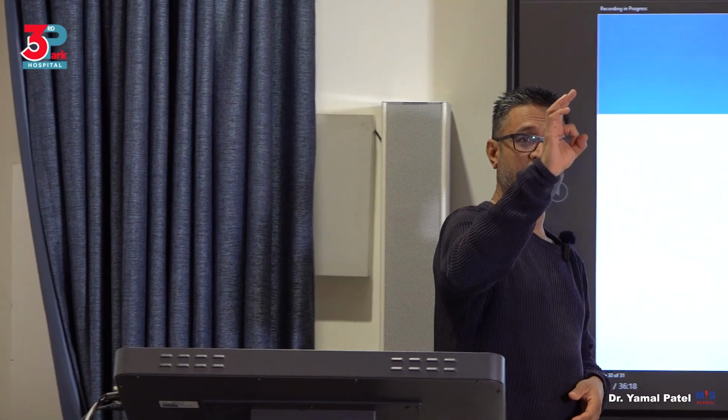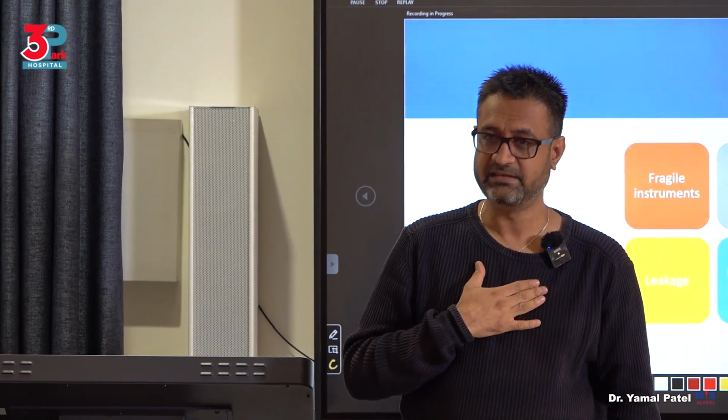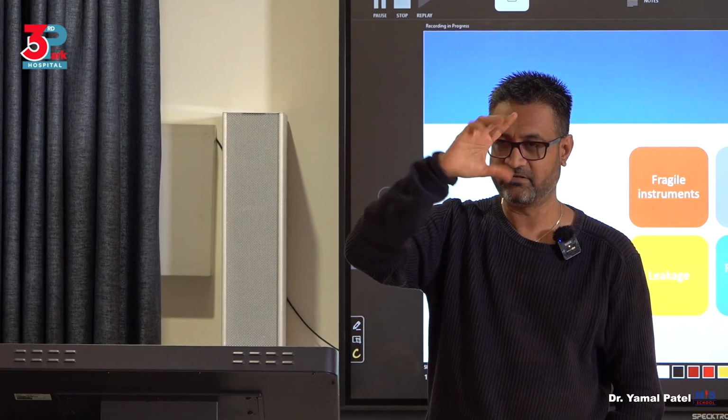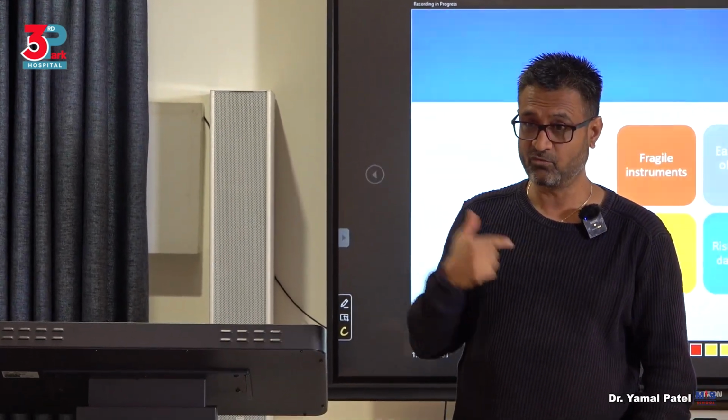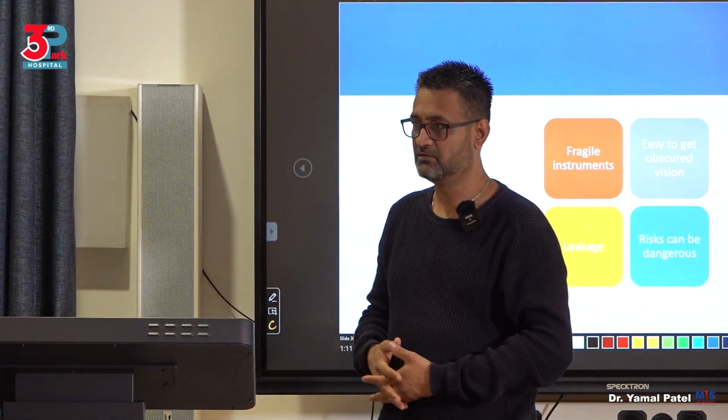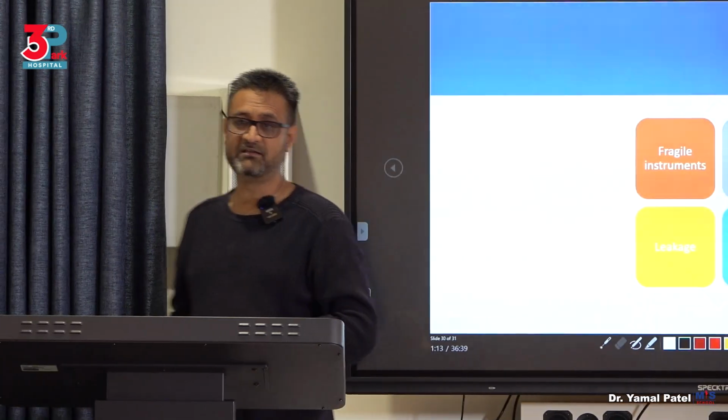So your whole scope will become red. You've understood? So you have to know how to proceed from there, because that's what we call the Japanese flag effect. If you have seen the Japanese flag, it's a red circle in a white. That's what you will see, that you have your screen and suddenly your scope is just red. Now you have to be careful with that, because you can't operate when you have a Japanese flag effect, okay?